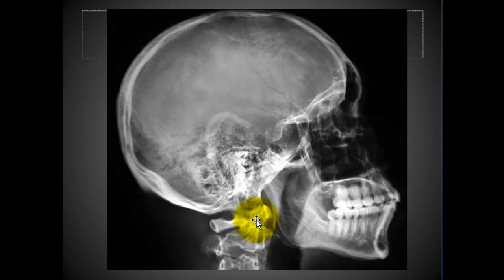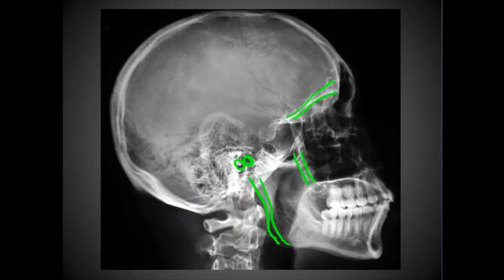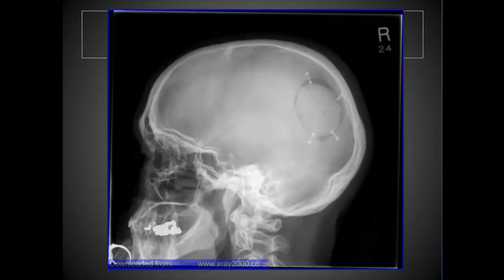Any vertical structure you can tell is not superimposed, and that's an indication of rotation. Looking at EAMs, posterior walls of maxillaries, and the mandibular rami confirms this.